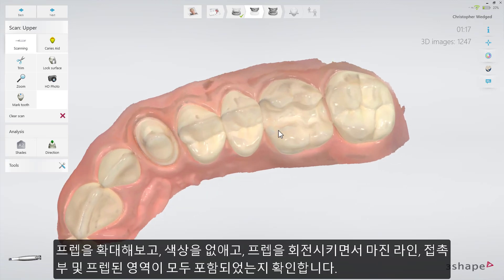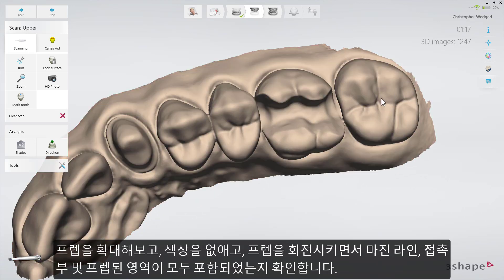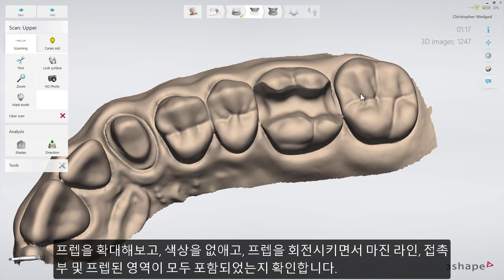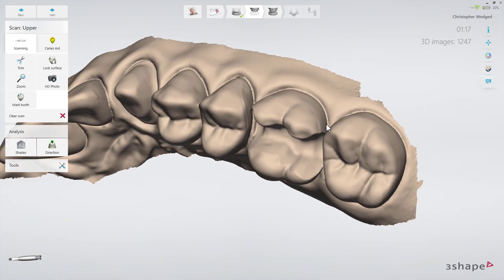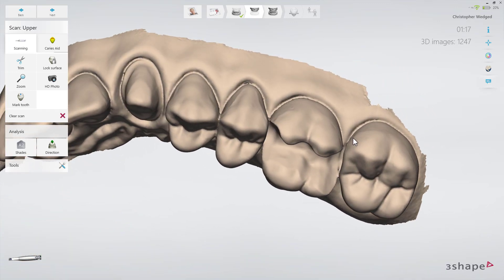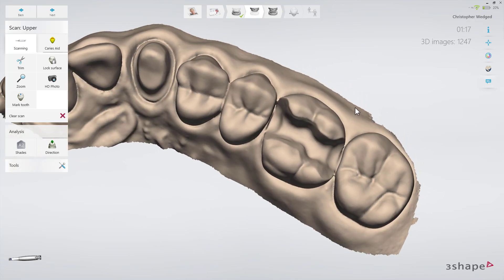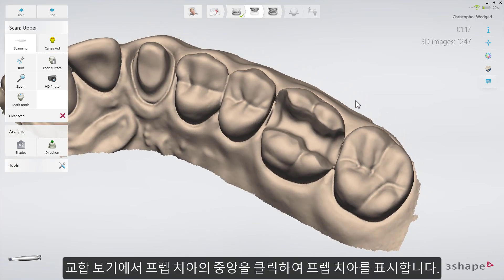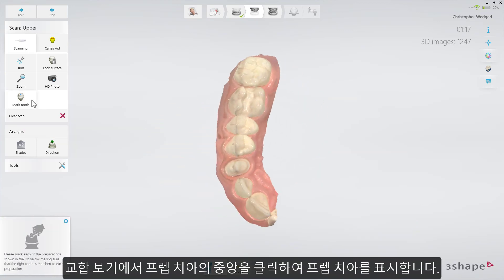Do this by zooming in on the preparation. Turn off colors and rotate the preparation. Mark the preparation by clicking the center of the preparation when seen from the occlusal view.